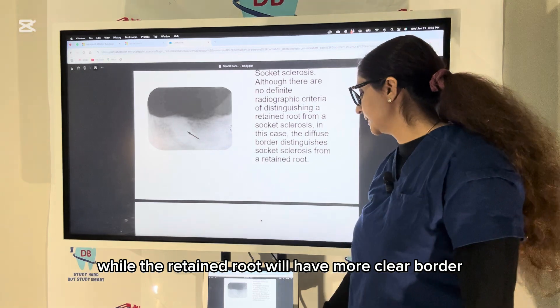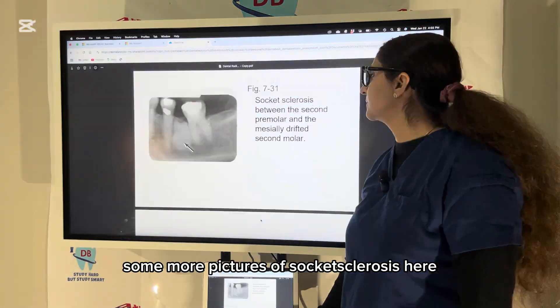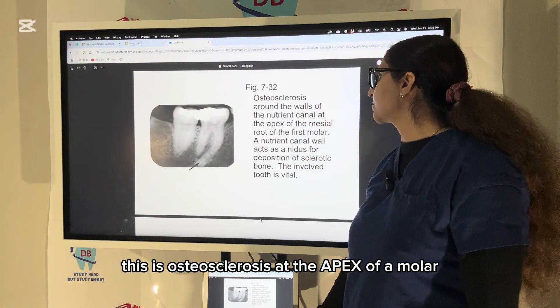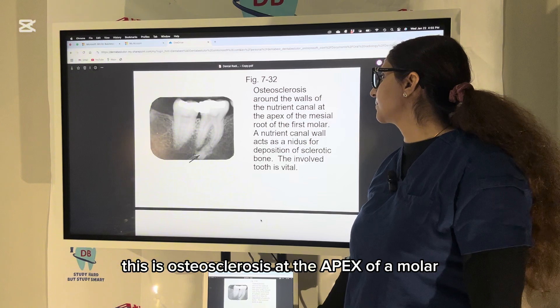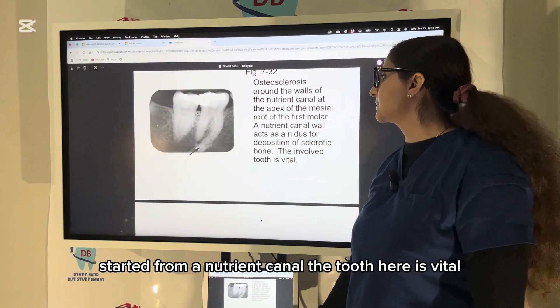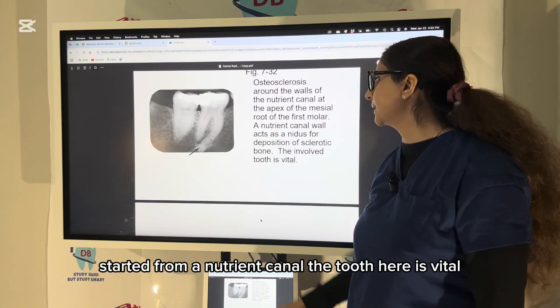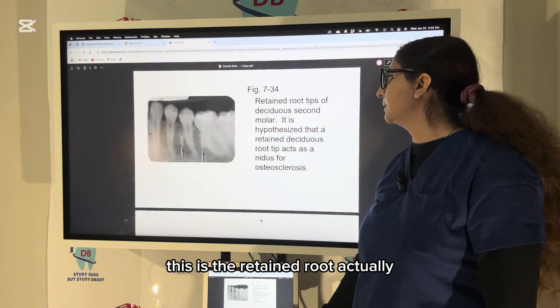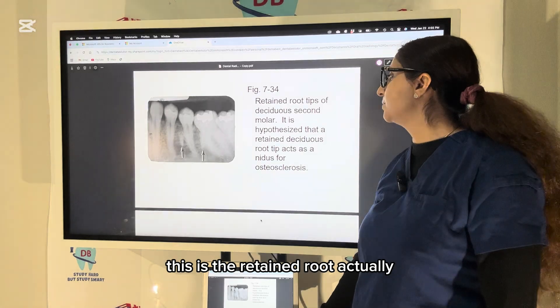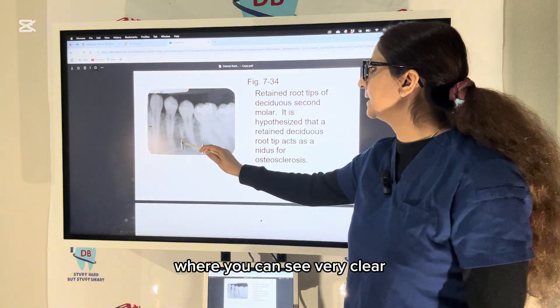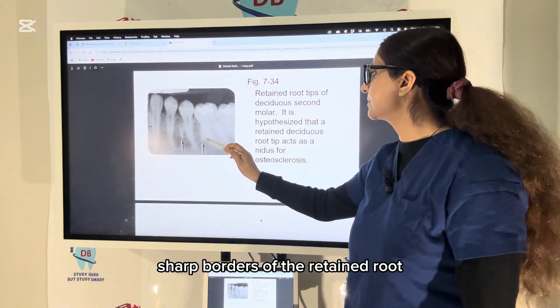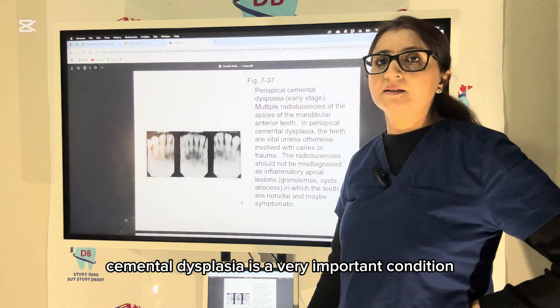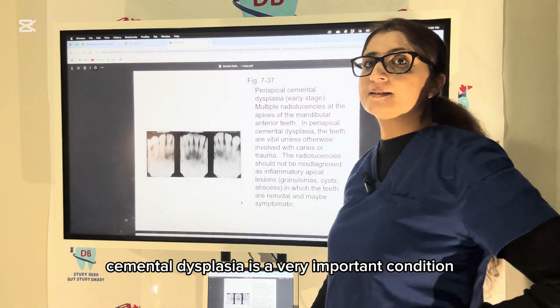How to distinguish socket sclerosis from a retained root: socket sclerosis has a diffuse border, while a retained root will have a clearer, more defined border. Some more pictures of socket sclerosis. This is osteosclerosis at the apex of the mesial root of the first molar, originating from a nutrient canal; the tooth is vital. This is the retained root, where you can see very clear, sharp borders.